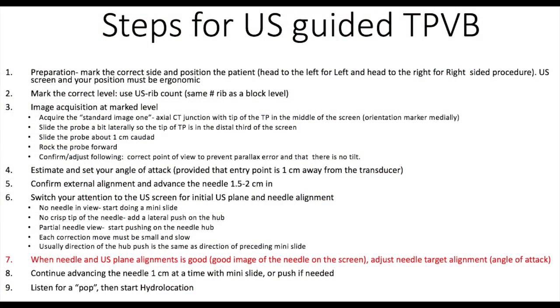When the needle and ultrasound plane alignment is good, adjust the needle target alignment.